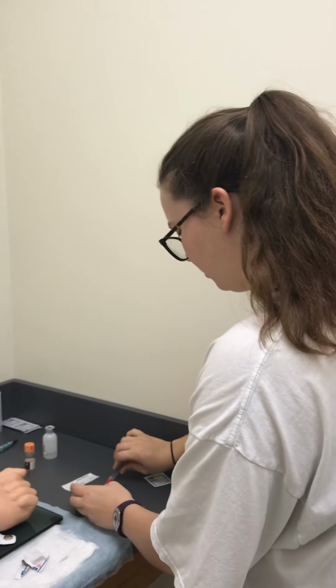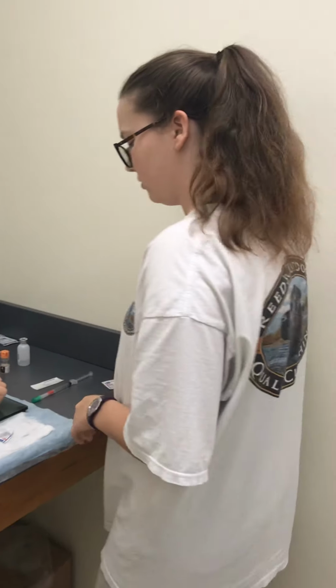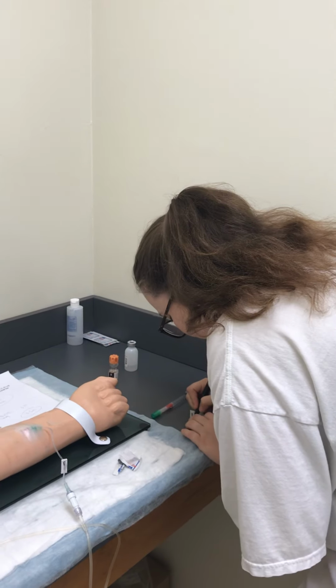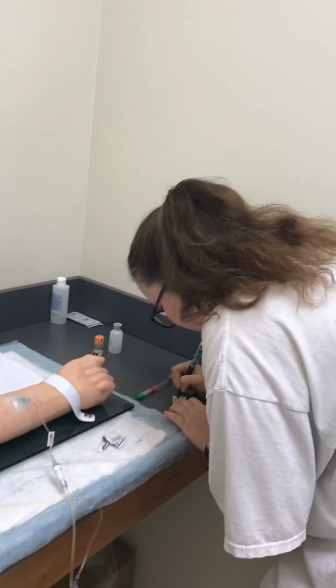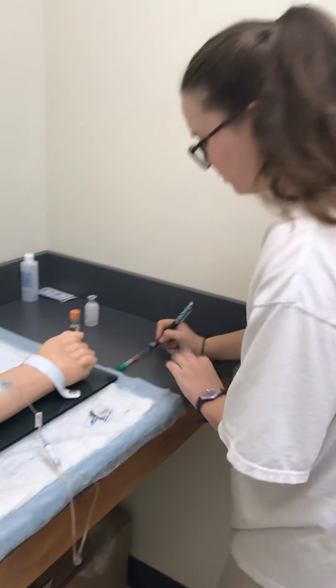Now I'm going to recap and fill out my label. Putting down 10 milligrams Solu-Medrol and put my initials on it.